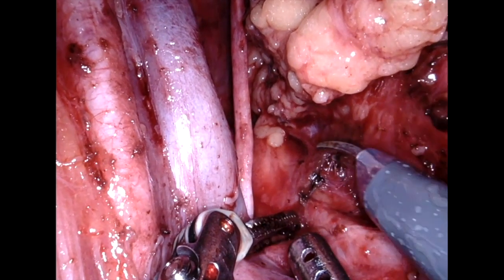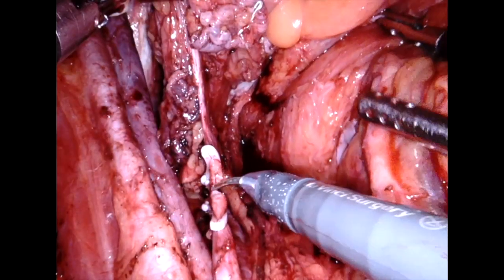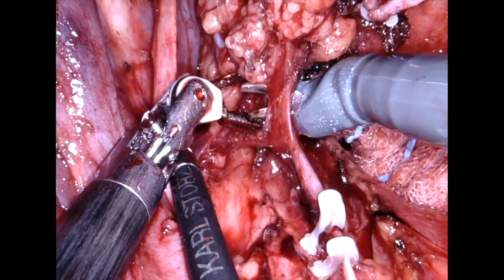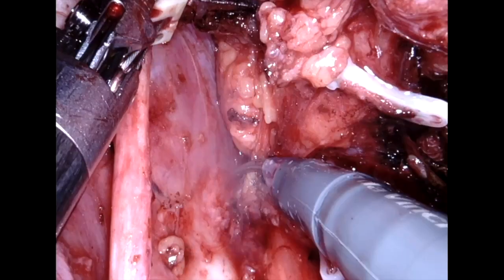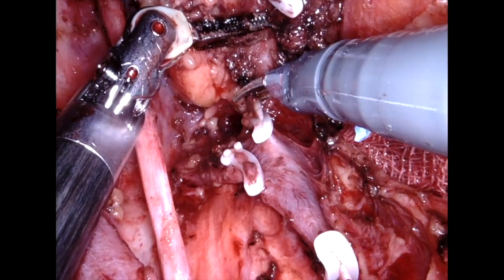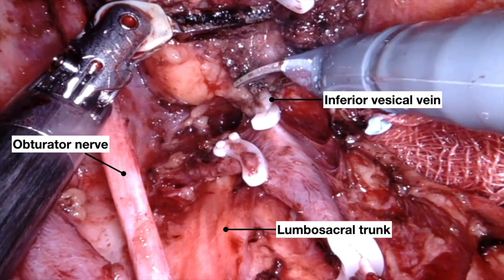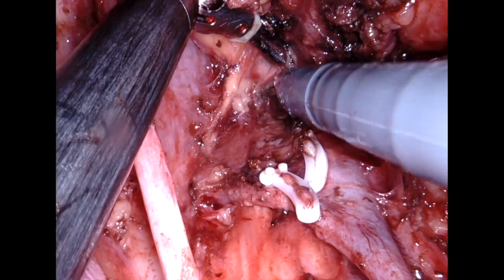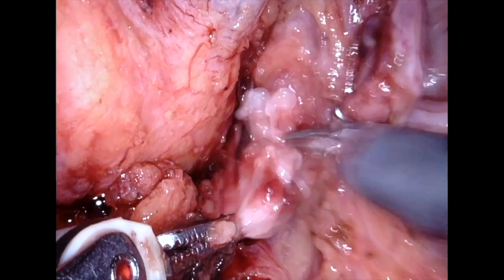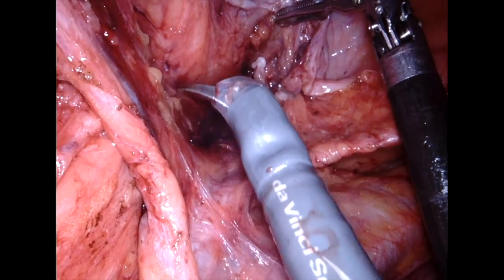Once the dissection along the internal iliac artery has been completed, it is clipped and divided, followed by dissection of the internal iliac vein and clearing of the nodal tissue along the inferior vesical vessels. We can see the obturator nerve and the lumbosacral trunk being identified and preserved. Following this, the right ureter is clipped and divided and mobilized for future urinary reconstruction.